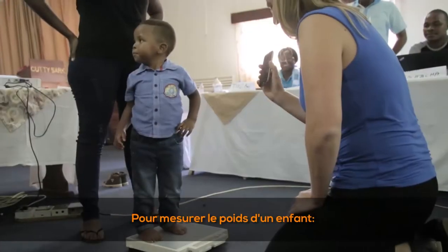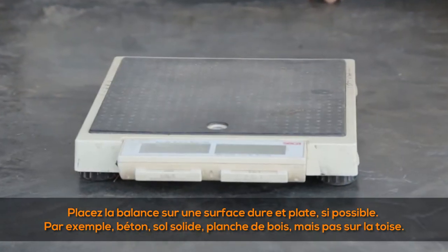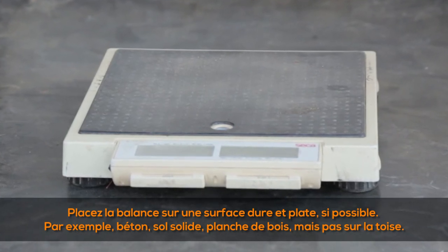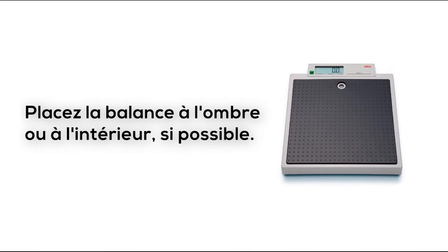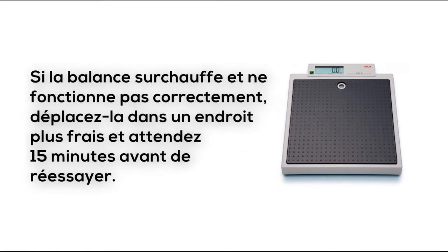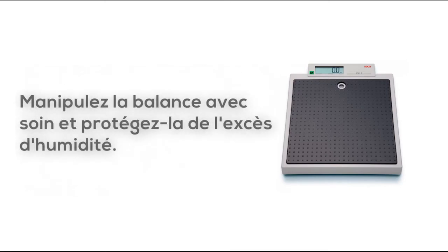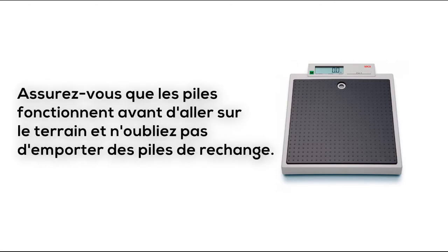To measure the weight of a child, place the scale on a hard and flat surface if possible — for example, concrete, solid ground, or a wooden board, but not on the height board. Place the scale in the shade or indoors if possible. If the scale overheats and does not work properly, move it to a cooler place and wait 15 minutes before trying again. Handle the scale with care, protect it from excess humidity, and ensure the batteries are working before going to the field. Carry a spare set.